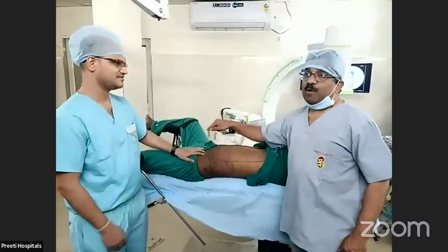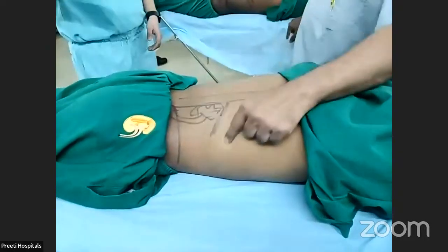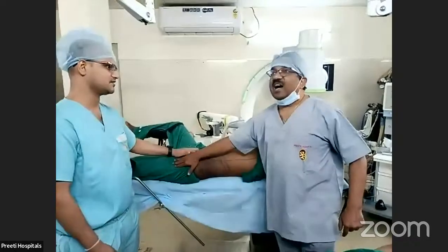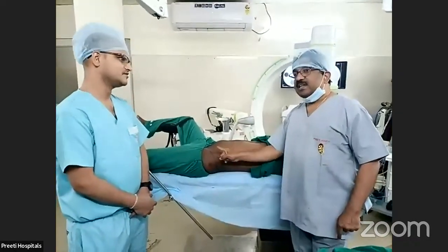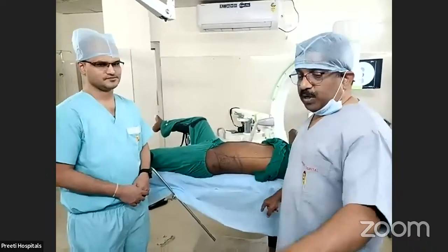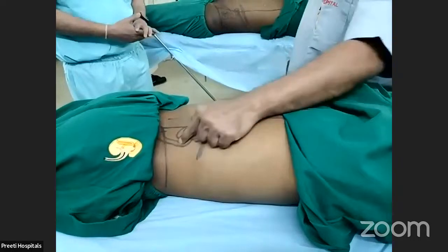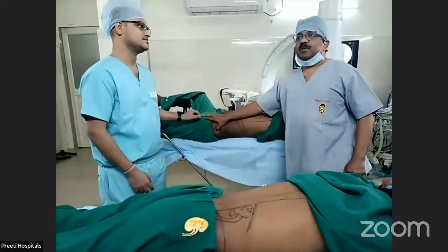It's difficult. If you can puncture the inferior calyx, all the stones can be removed. Because if you can puncture the superior calyx, all the stones can be removed. Here it is the supracostal, here it is the iliac, both ways. So if the lower calyx can be reached easily with supine PCNL, you can remove all these stones. If you can reach the upper calyx easily with prone PCNL, you can reach all these stones. Here supracostal is the problem. Here the iliac crest is the problem.